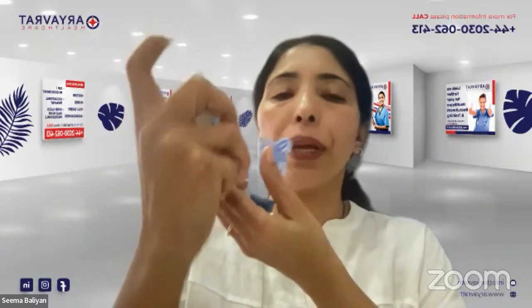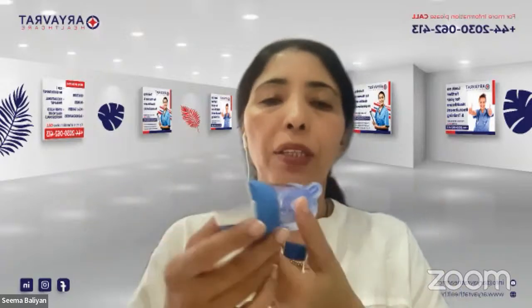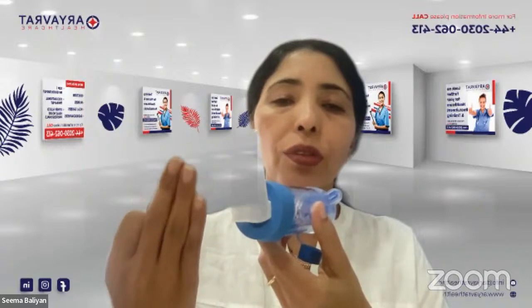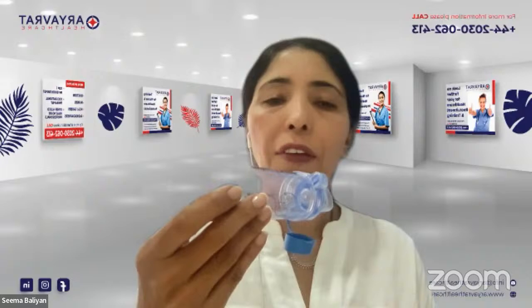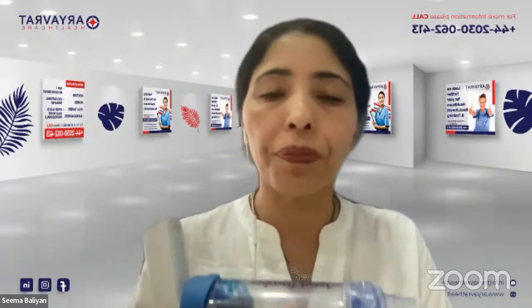So you are going to be pressing the canister. And you are going to count that the patient has taken 5 breaths. So you'll count 1, 2, 3, 4, 5. Once the patient has taken the 5 breaths, you are going to take this out and ask the patient to close their mouth.